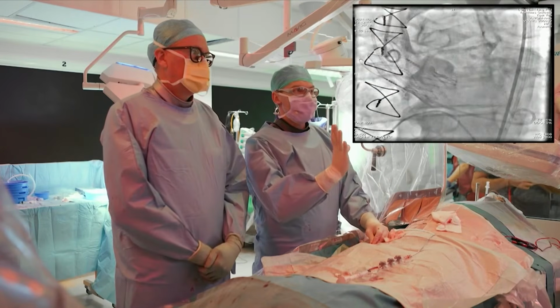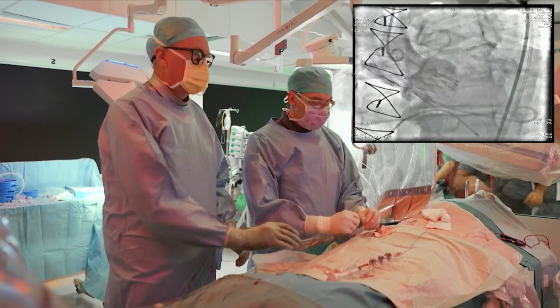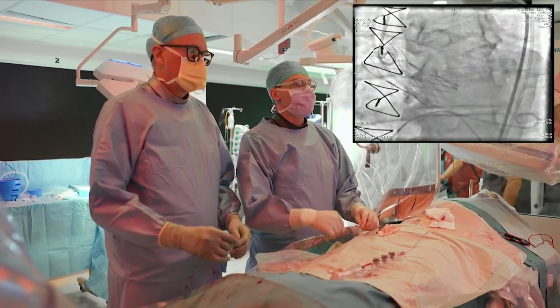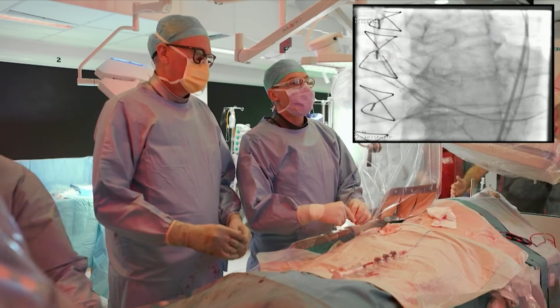So, it may also be one of the beautiful things about this ACURATE platform. It's very easy to see it, and you have different techniques to actually obtain it. So it's probably the platform we have today where you have the highest success rate to have commissural alignment.